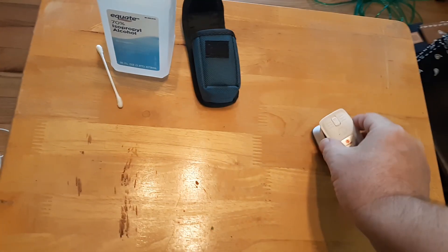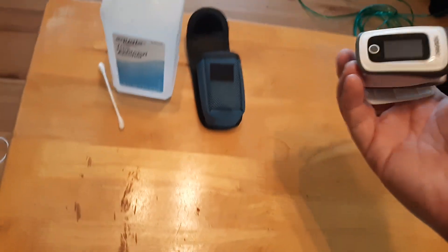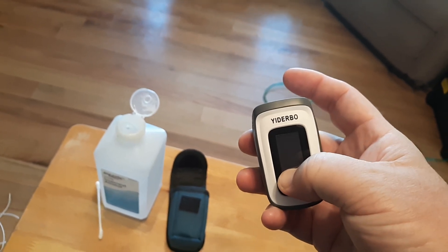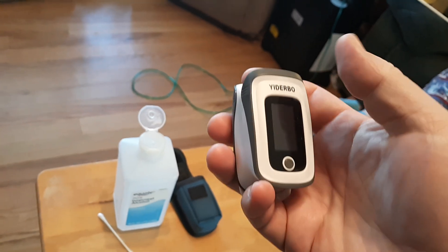Now if you've done that and it's still not working, what I want you to do is hold down the power button — press it down and hold it, even if it's 20 seconds — and then let go.